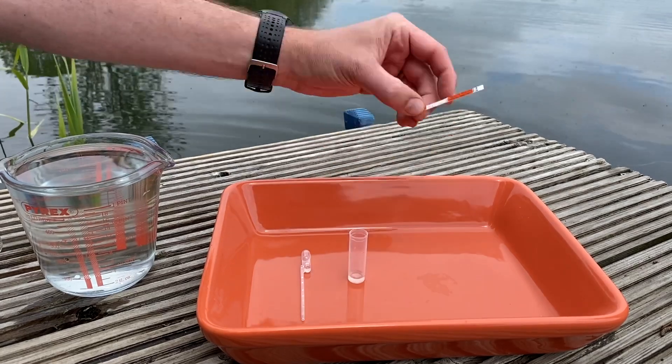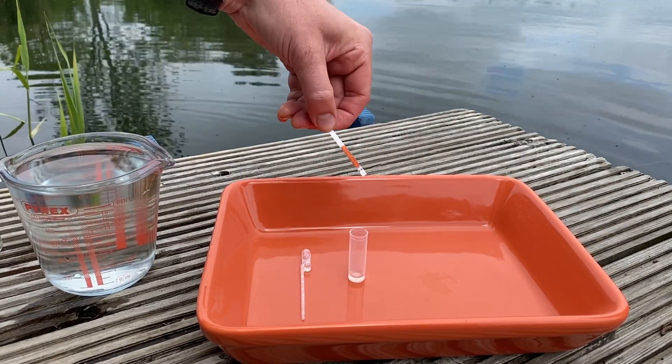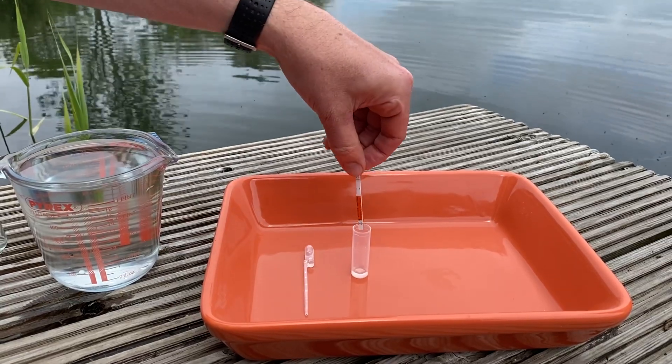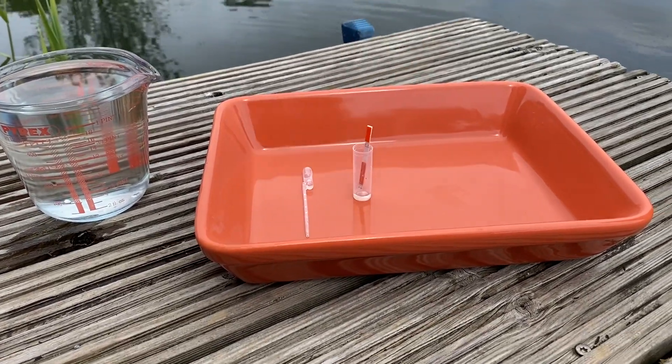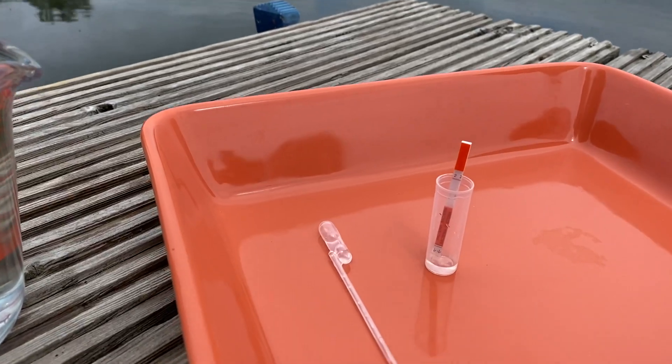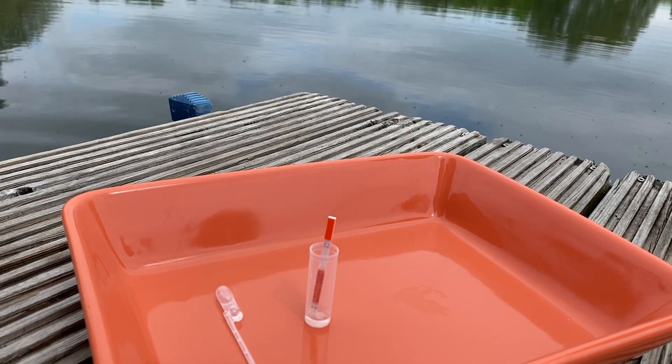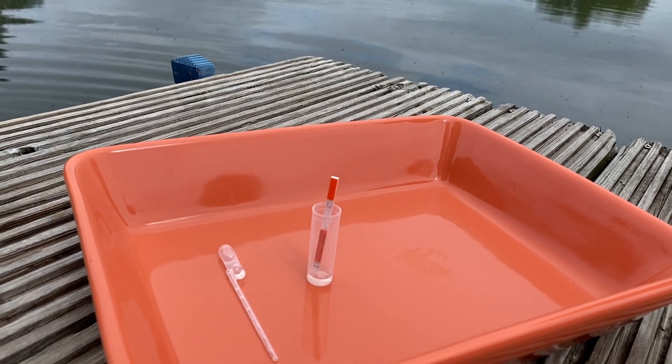Once that five minutes is over, you'll get your test stick. Make sure the two arrows are facing downwards, stand that into the vial, and we need to let that stand for 10 minutes. The important thing is do not move that test vial — do not pick it up or anything like that.